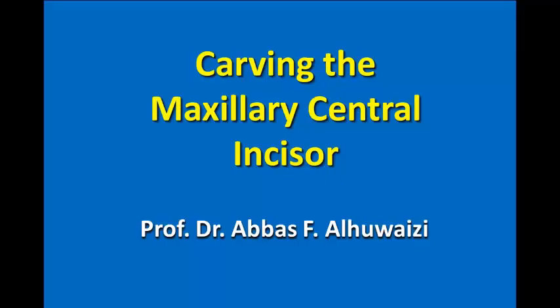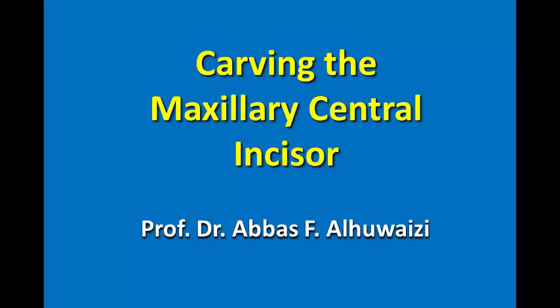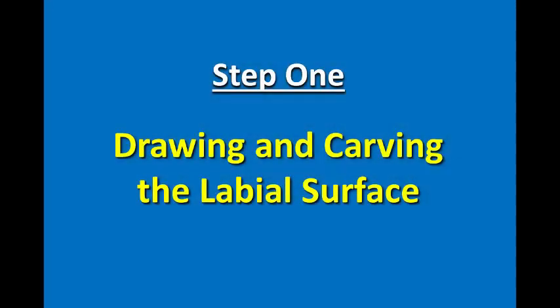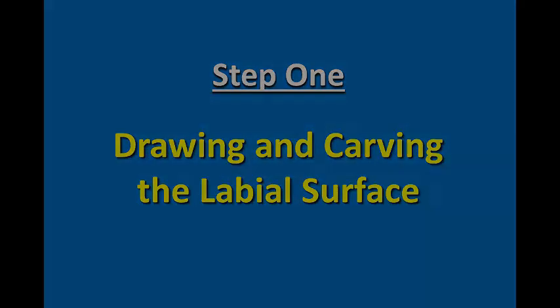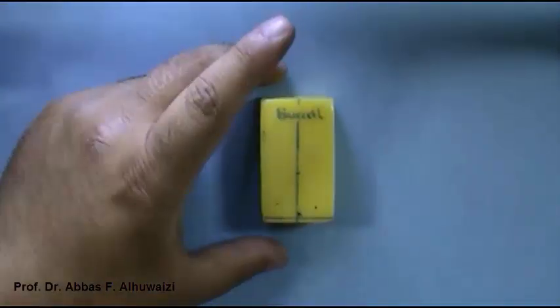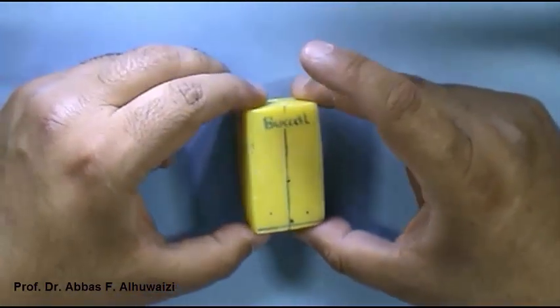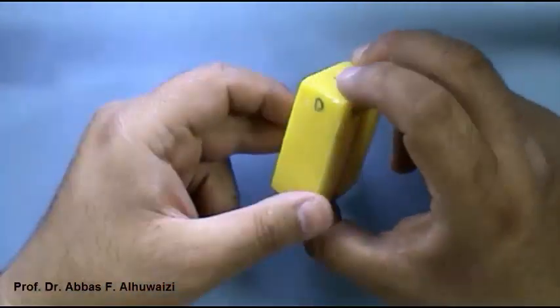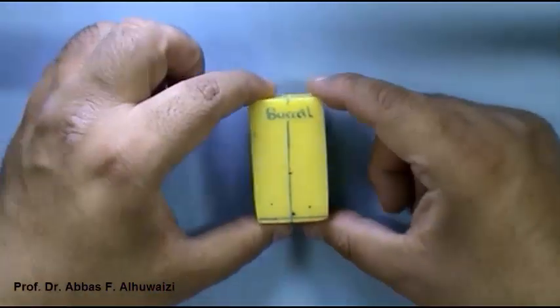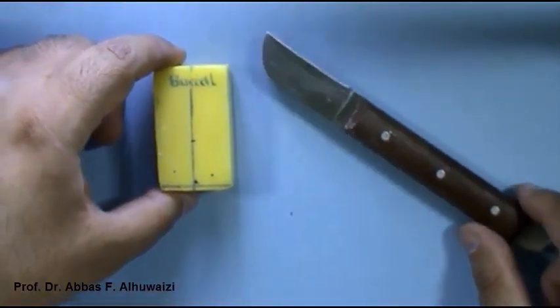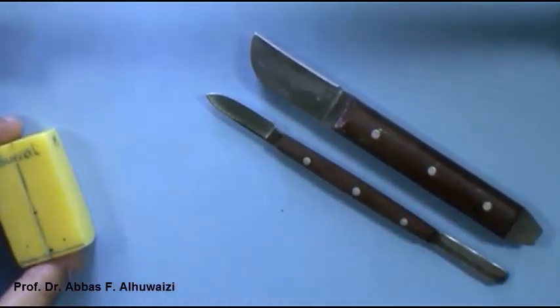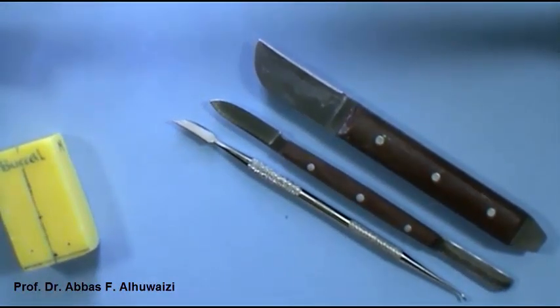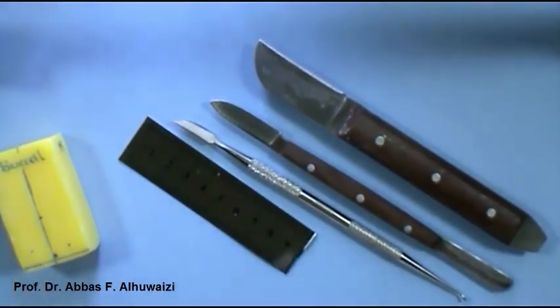Carving the maxillary central incisor. Step 1: Drawing and carving the labial surface. First, we prepare a block of wax or soap in specific dimensions. Then we prepare the plaster knife, wax knife, Le Cron carver, ruler, and a marking pen.